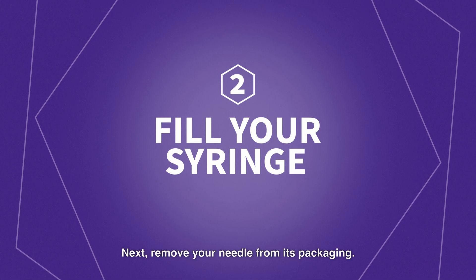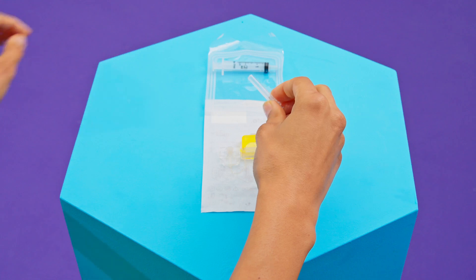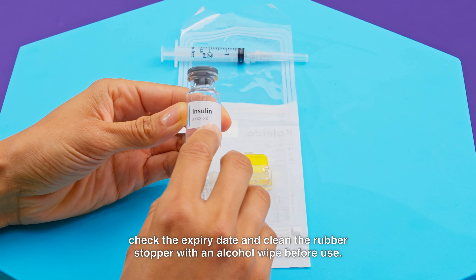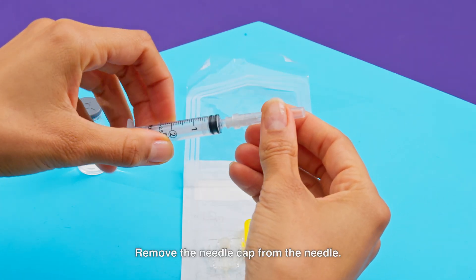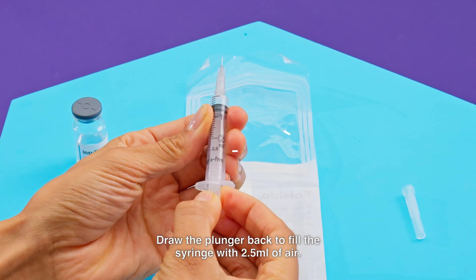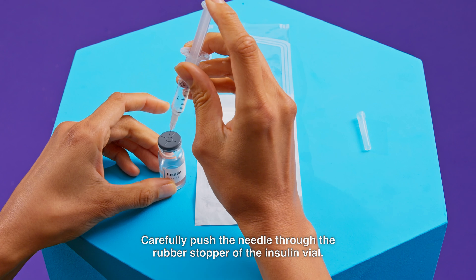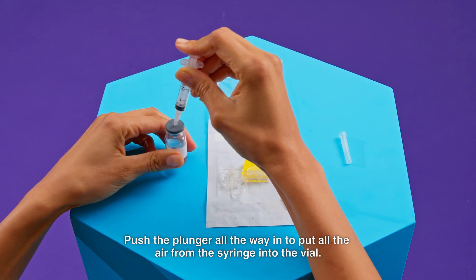Step 2: Fill your syringe. Remove your needle from its packaging and push the needle onto the tip of the syringe until they are connected. Take your room temperature insulin vial, check the expiry date, and clean the rubber stopper with an alcohol wipe before use. Remove the needle cap from the needle. Draw the plunger back to fill the syringe with 2.5ml of air. Place the insulin vial in front of you onto the flat surface and carefully push the needle through the rubber stopper of the insulin vial.